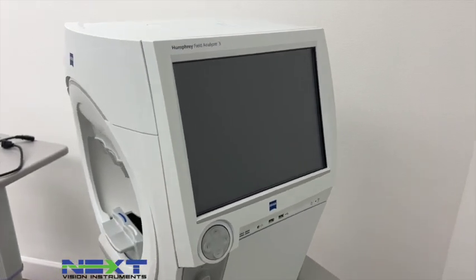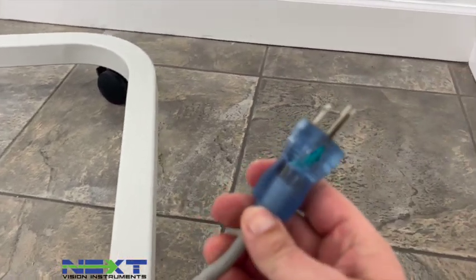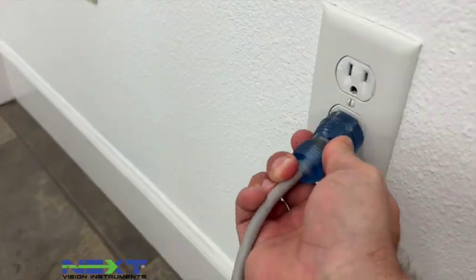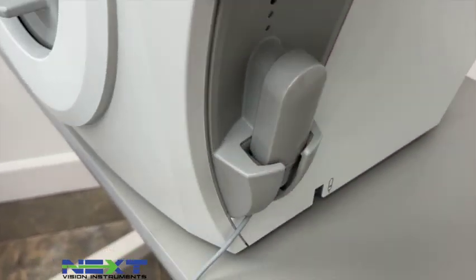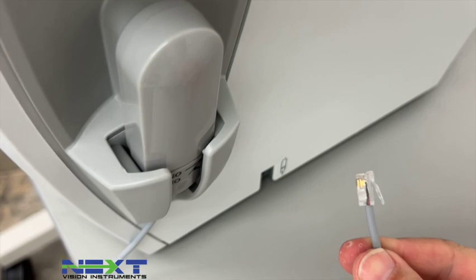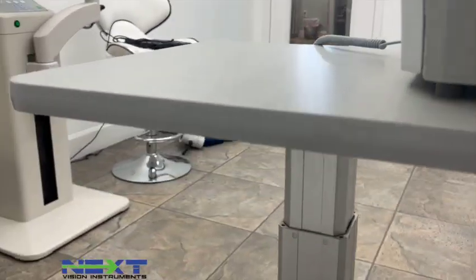The user's manual can also be found on the machine itself, but we include the thumb drive as an extra. The first thing I'm going to do is plug the power cord into the table and this end into the wall. Next I'll grab the patient response button — it has a little cup here and this end is like a phone jack that will just click into place.